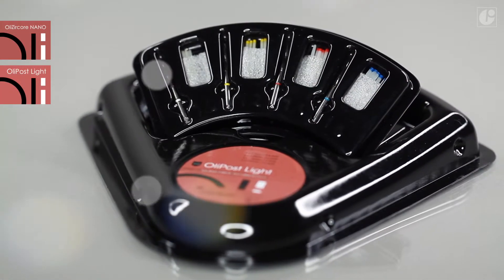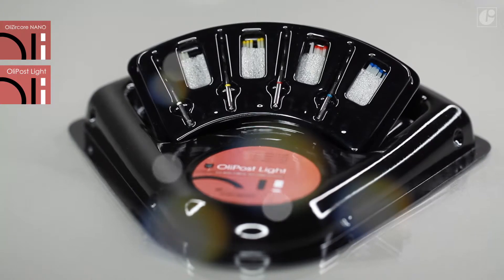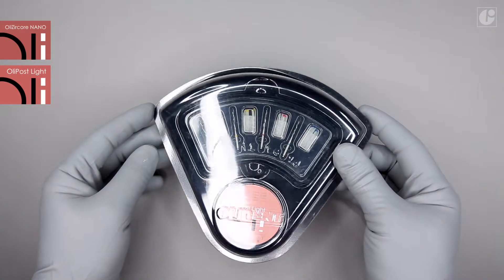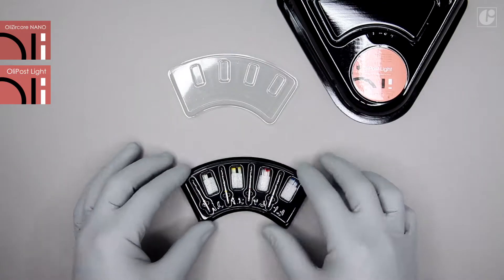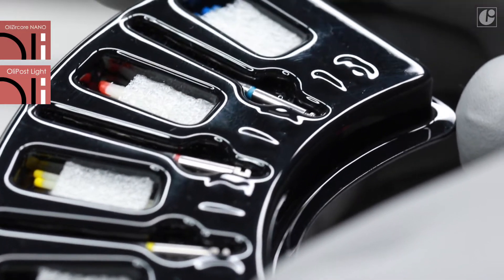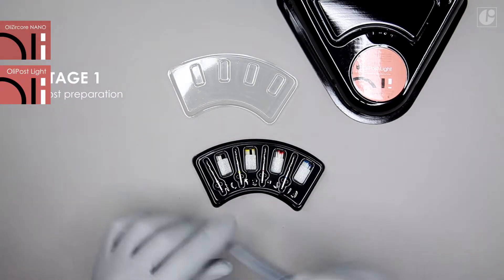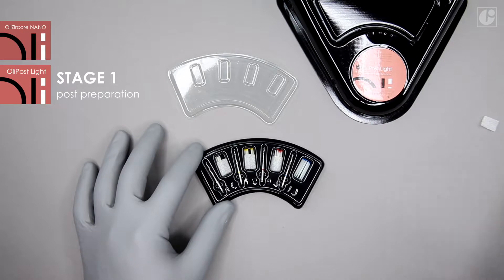OliPost Light Endodontic System is an ideal partner for OliCircore Nano. The root posts are made of longitudinally placed glass fibers sealed in epoxy resin. The conical shape of the post guarantees appropriate distribution of tension, hence secures and reinforces the reconstruction.